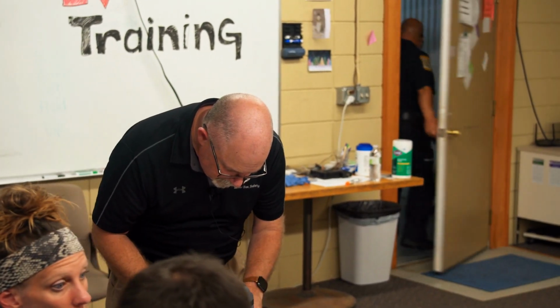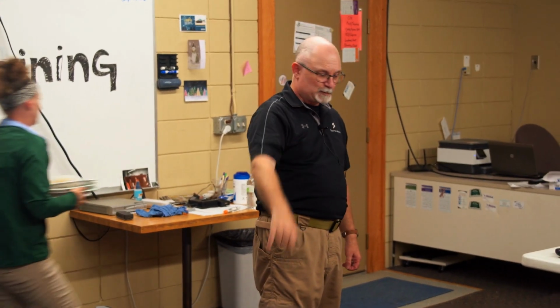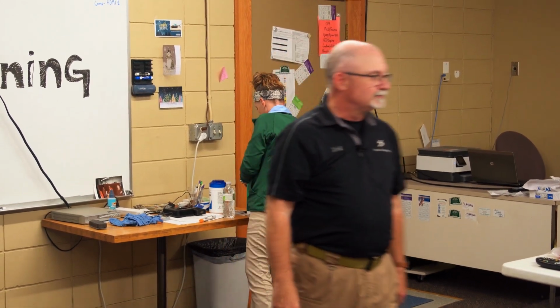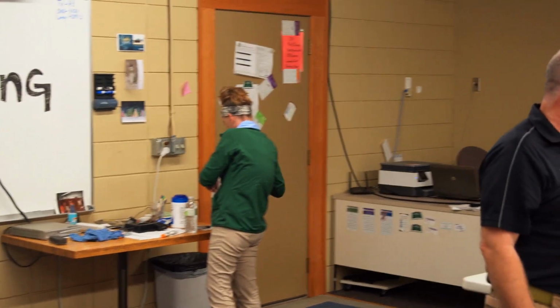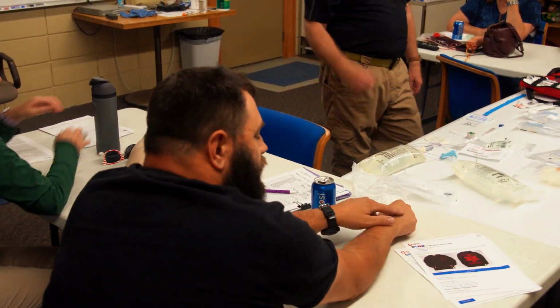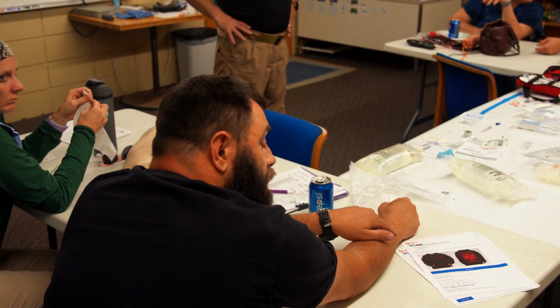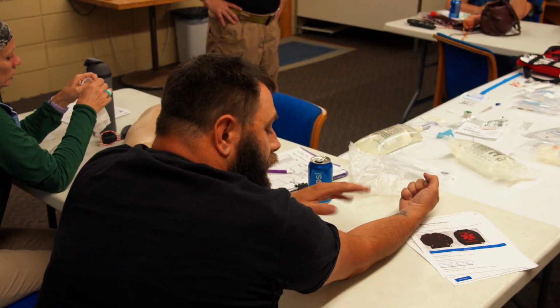Joey, do we have a place where we have to do, like, do we have to do up here? Can we do it here? Well, typically, you want to start low and work your way up. Yep. And we're going to go over that, but keep going. But again, if you need to get that IV in and you see a monster right here, you can pop it. If you have a dehydrated patient, you're going to want to go to where you can see one because you're not going to get any on a dehydrated patient or a nursing home patient. I just put an IV in a nursing home patient just last week, and I just went right for this.